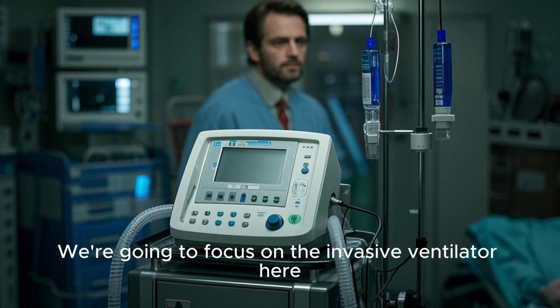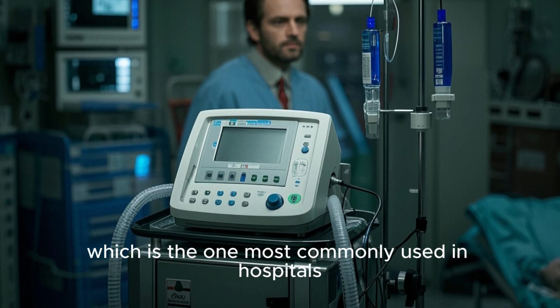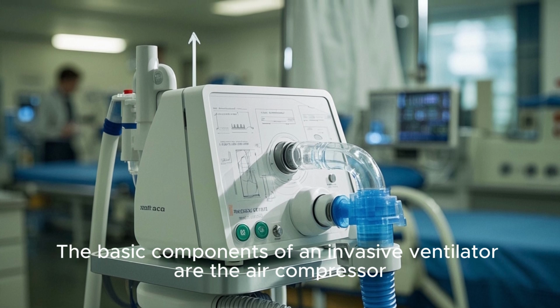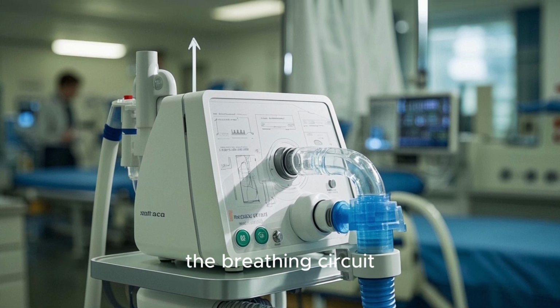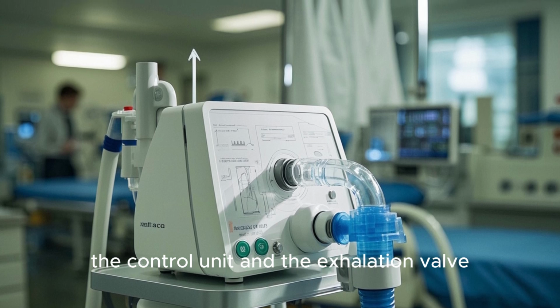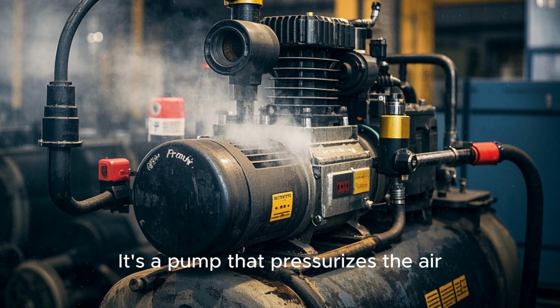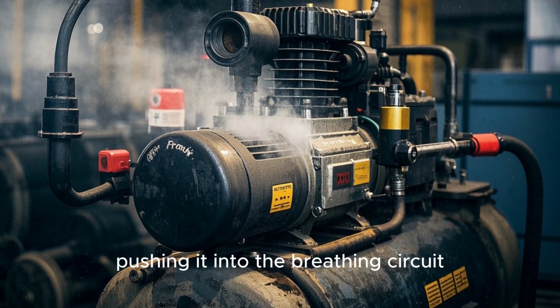We're going to focus on the invasive ventilator here, which is the one most commonly used in hospitals. The basic components of an invasive ventilator are the air compressor, the breathing circuit, the patient interface, the control unit, and the exhalation valve. The air compressor is what powers the ventilator. It's a pump that pressurizes the air, pushing it into the breathing circuit.